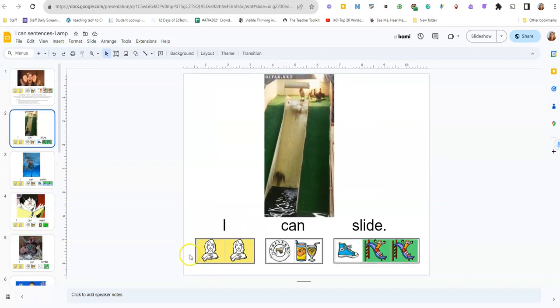Also, on the bottom of the slide, you'll see a script that contains a sequence of the buttons that you need to press to get to a word. There's a lot of repetition in this activity, which is perfect for helping the students learn where the words are. They don't have to be able to read, they will be learning from motor memory.